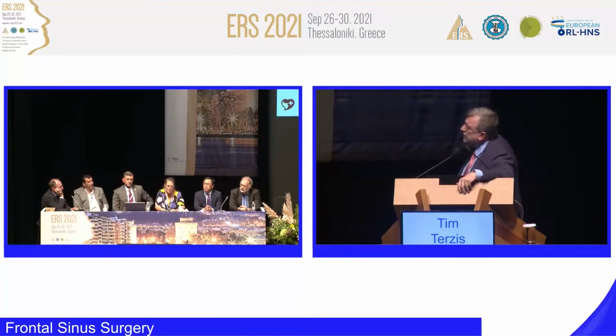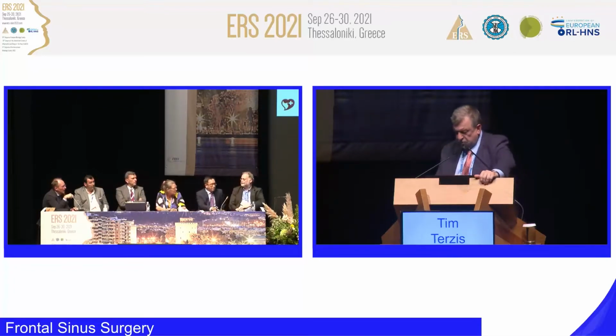Totally agree. Anybody else want to comment? Yes, Philippe? I think that when we do a Draf 2B, we must drill a lot. Yes. And at the beginning, we think that, well, the opening is okay, it will heal. No, you have to drill a lot, and you must remember that when you think it's enough, the procedure starts. That's a very important thing. Yes, good point.